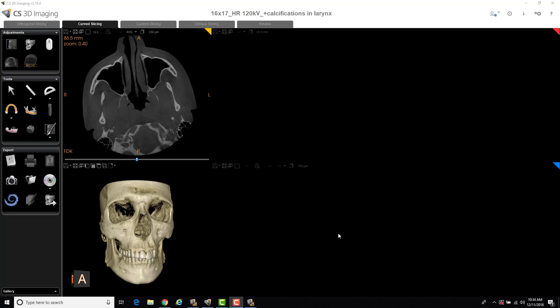So here's a video on using the reformatting tool using the CS3D imaging software. There's a few different applications of using this tool. I'll cover at least a couple of them in this video.